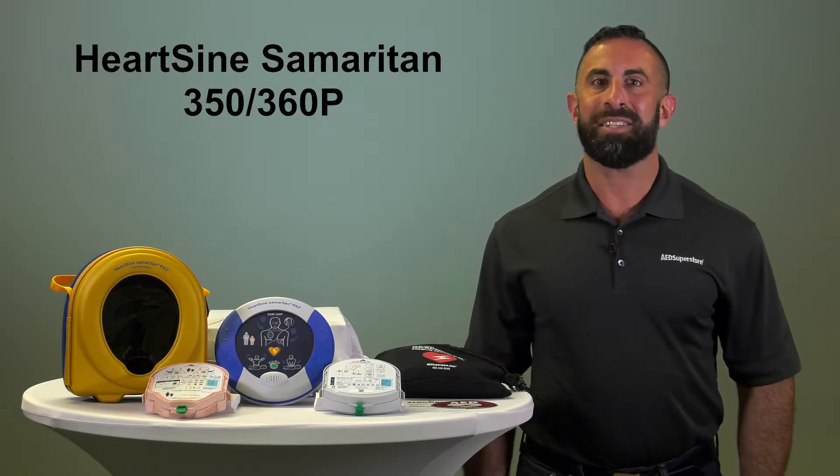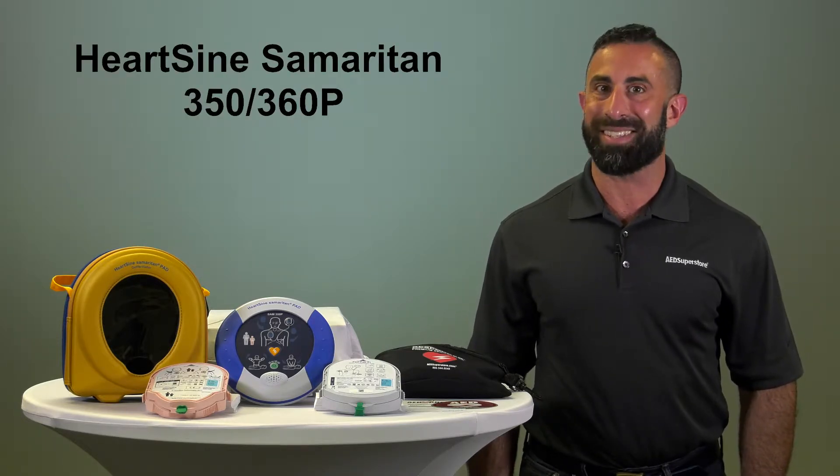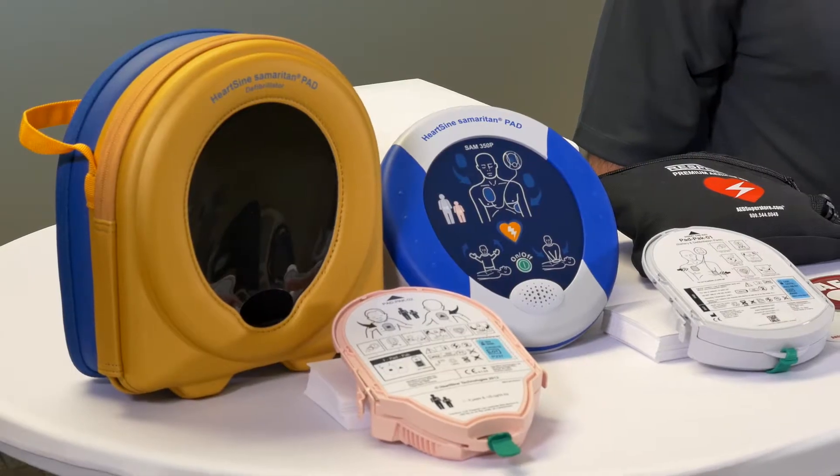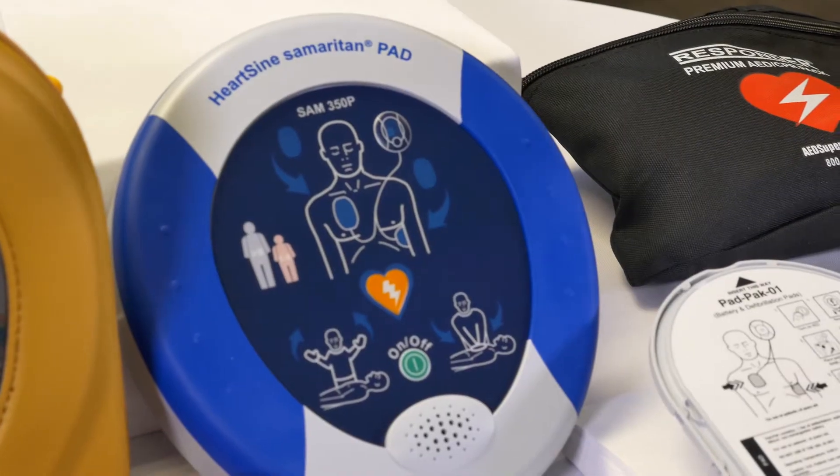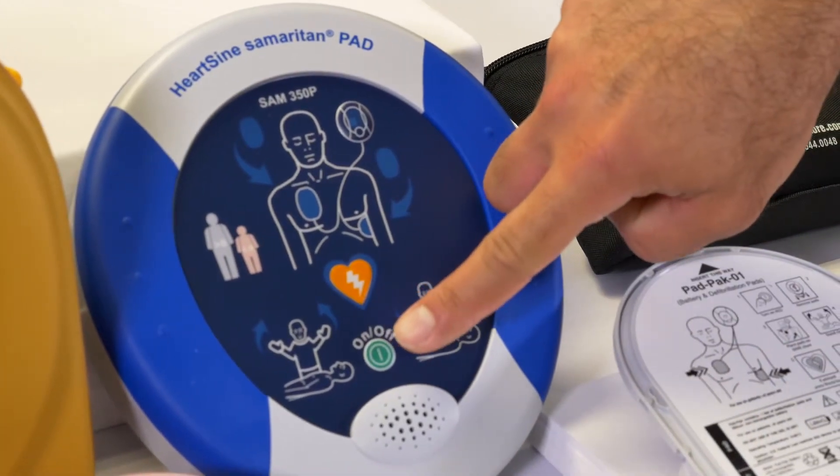Today we're going to talk about the features and benefits of the HeartSine Samaritan 350 and 360P. The HeartSine Samaritan 350 and 360p are both very user-friendly. Just press the on-off button — it's actually that simple.